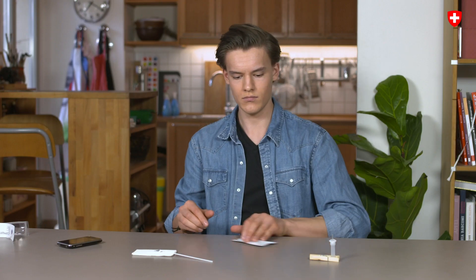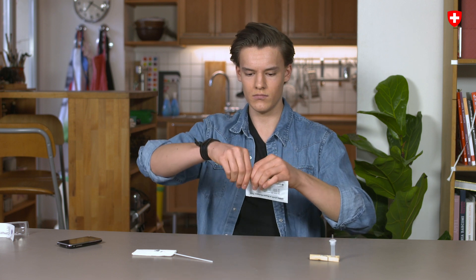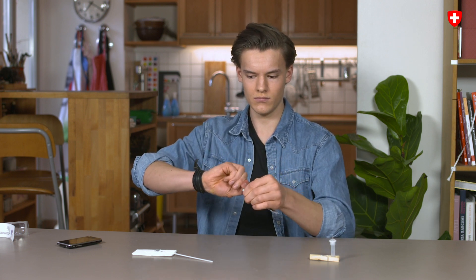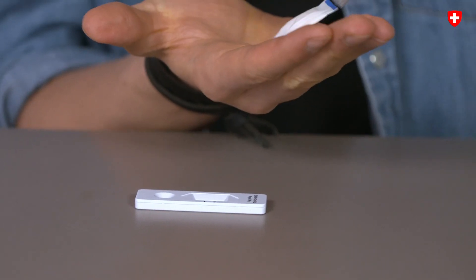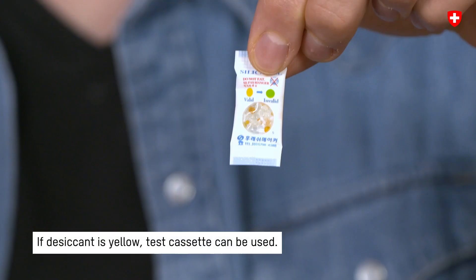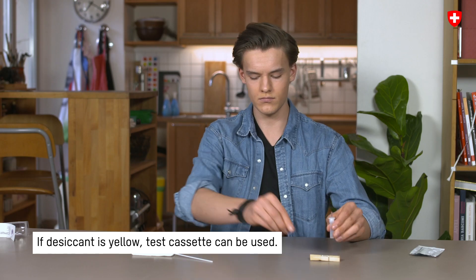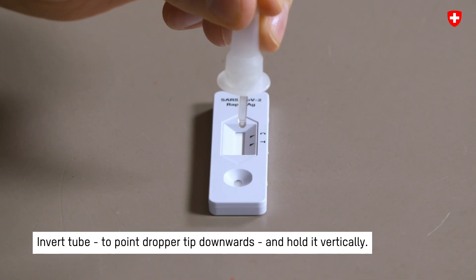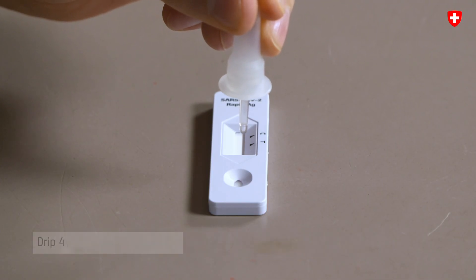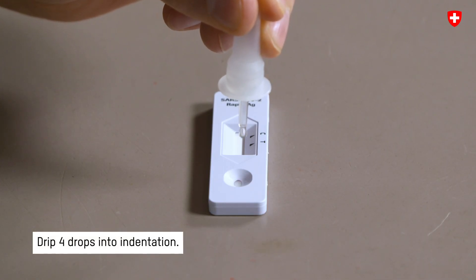Step 6: Open the test cassette and place it on a clean surface. If the desiccant in the small bag is yellow, the test cassette can be used. The small bag will be disposed of later. Invert the tube and hold it with the dropper tip vertically downwards. Then drip 4 drops into the indentation while gently squeezing the tube.